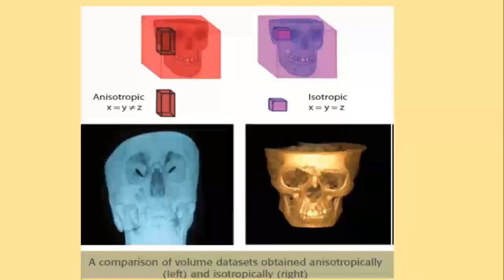So hence, that fidelity that you get, any amount of rotation, planes, do where you want, the size is not going to differ. It's not going to change at all. So that's the advantage of having CBCT, because it gives you those isotropic voxels.